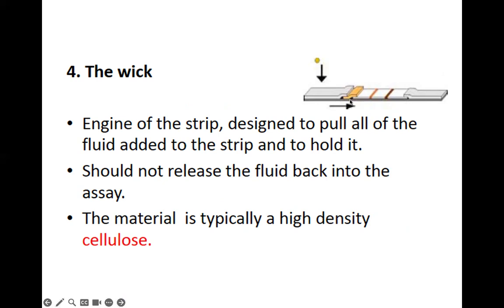And because a test strip is not sensitive enough like benchtop machines, if you do too much dilution, then you might not get a reading here because the sample might be moving too fast, so the capture antibody doesn't have the time to capture the antigen, or it might not have enough antigen in the sample because you have diluted too much.